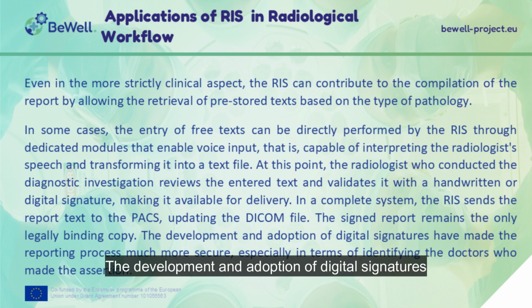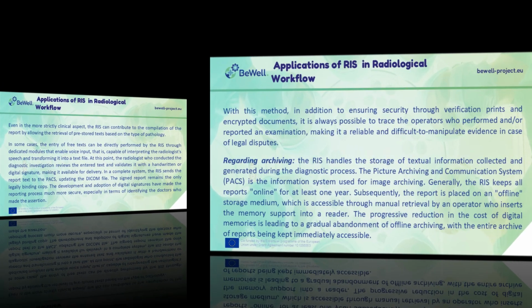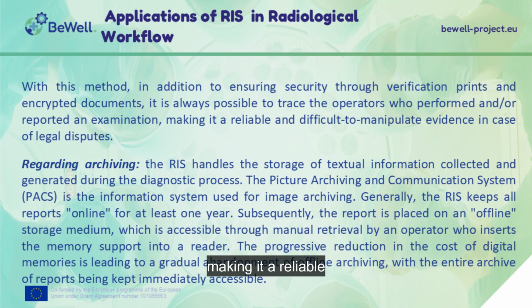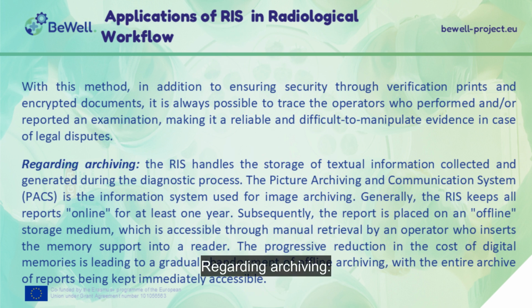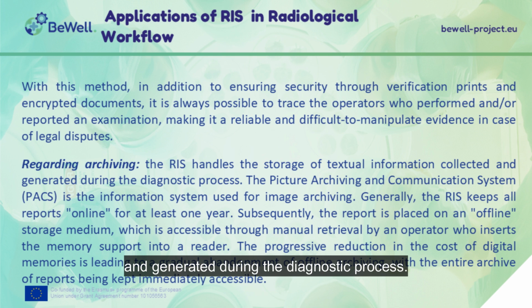The development and adoption of digital signatures have made the reporting process much more secure, especially in terms of identifying the doctors who made the assertion. With this method, in addition to ensuring security through verification prints and encrypted documents, it is always possible to trace the operators who performed and/or reported an examination, making it a reliable and difficult to manipulate evidence in case of legal disputes. Regarding archiving, the RIS handles the storage of textual information collected and generated during the diagnostic process.